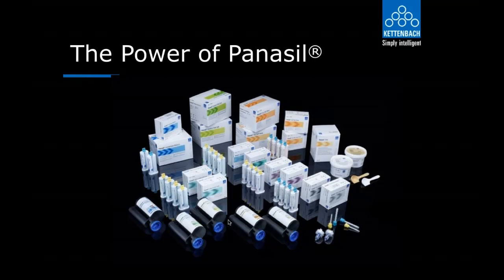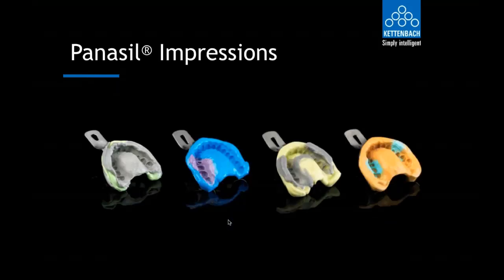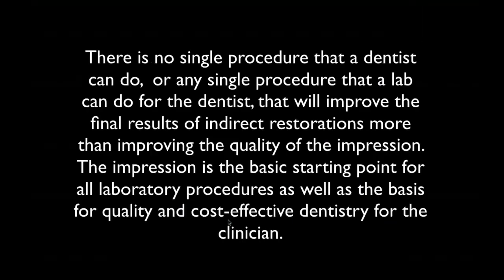And the sad part is you don't always notice the distortion. But when we go back and we study as to why the distortion took place, a lot of times, if you got more than 2 preps, it's because the impression material starts setting before you really got the tray material or the body material on it. So that is something. These, again, are the types of impression material.